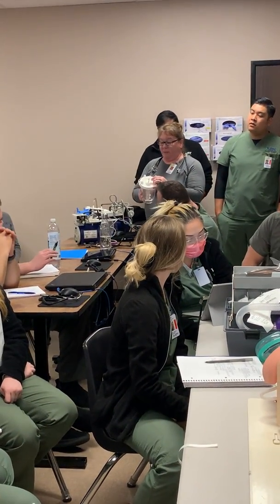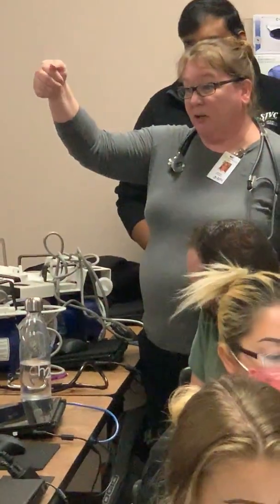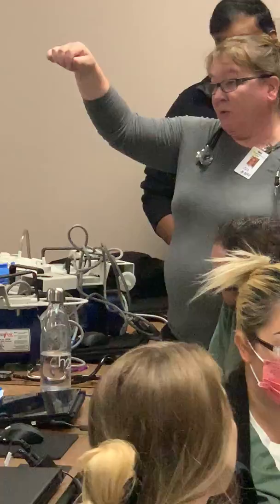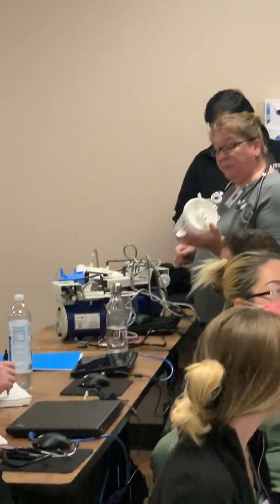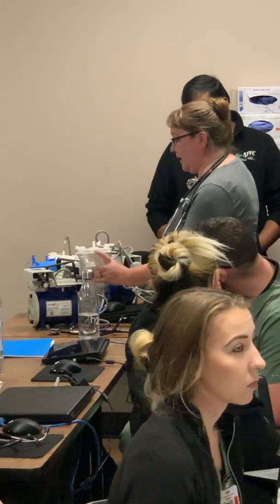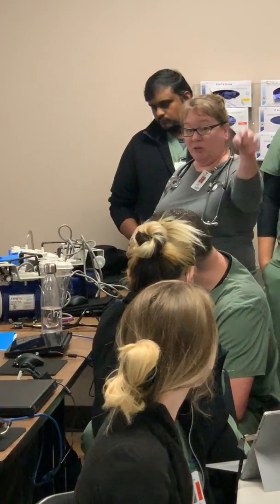You have to cap them when they come, because everything is off. You have to cap things and know to put your suction here. You can regulate the amount of suction by putting your thumb over the end of the suction tubing or on the catheter. You can check your suction pressure to see what it's at. That'll help too. Troubleshooting means making sure all your connections are on and you have your containers. If you want, get a little cup with some water to actually practice suctioning, and make sure you practice with your ballards.